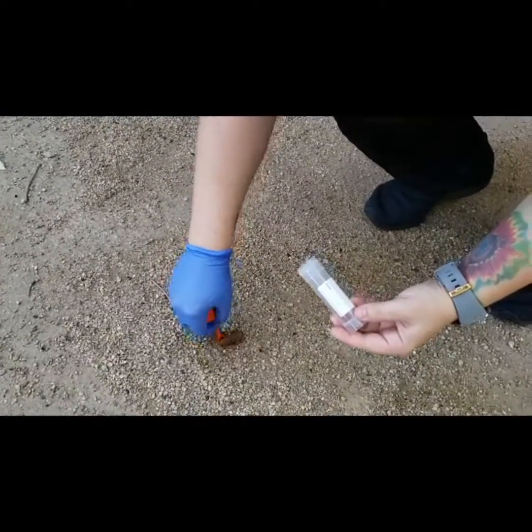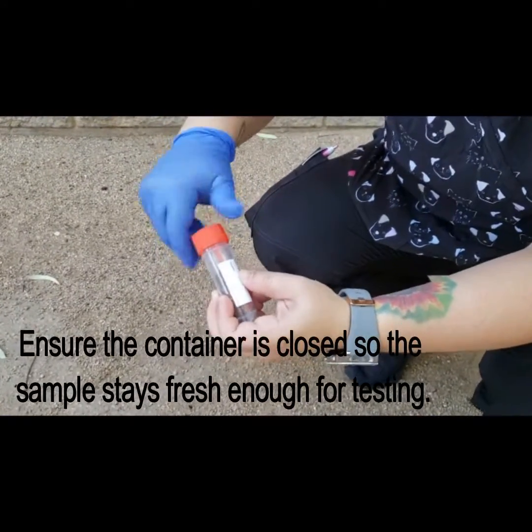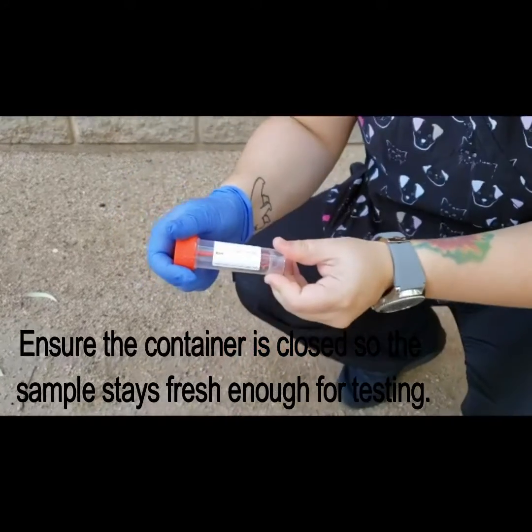We don't need that large of an amount. Go ahead and put it in there, close the lid up tight, and there you have it.